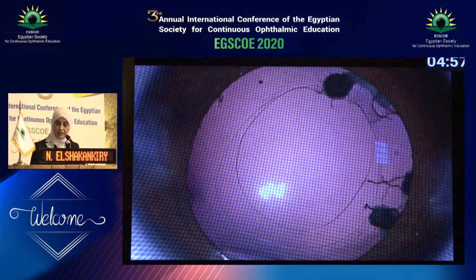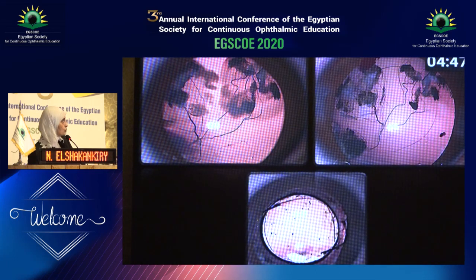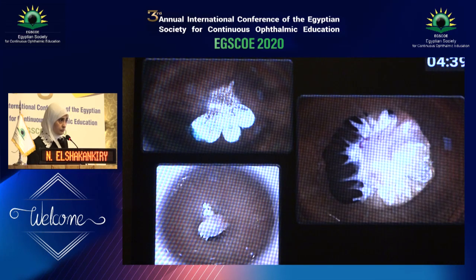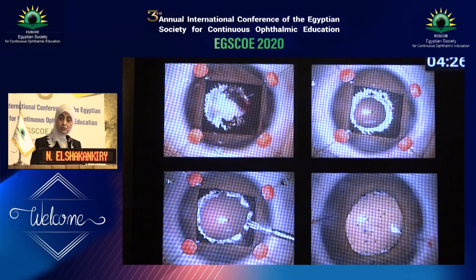We have now a beautiful capsular bag where we can inject the IOL between the anterior and posterior rhexis. And if the membrane is extensive, we can remove the whole posterior capsule and perform optic capture technique, as in this baby. But sometimes there is association between anterior and posterior tunica vasculosa lentis, as in these cases. Still in these cases, we can clear the visual axis and leave the eye aphakic, or in some cases, we can use iris retractors, perform the capsulectomy, radial tears, and primary IOL implantation.